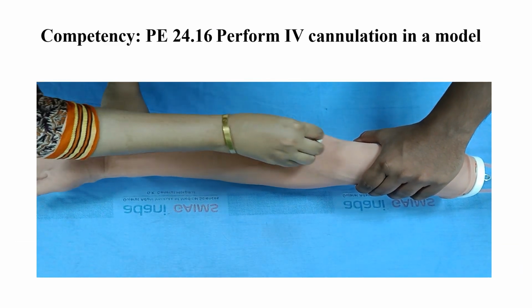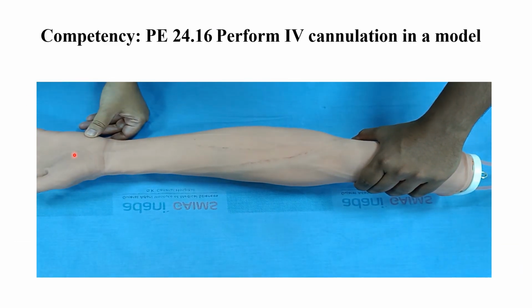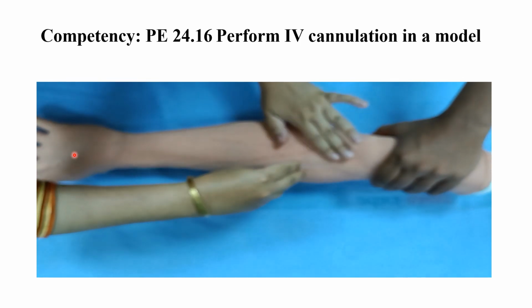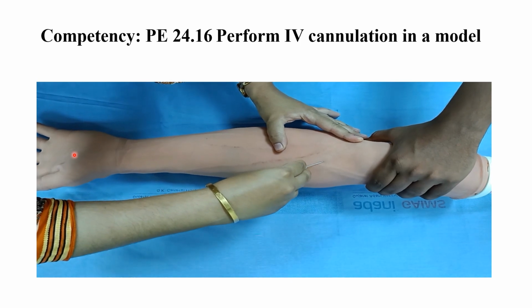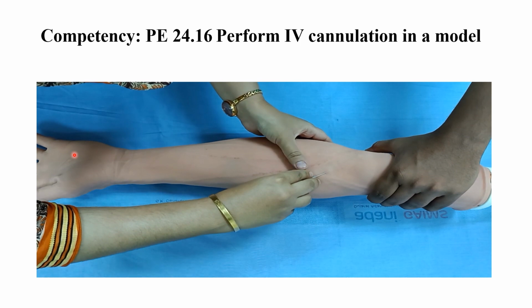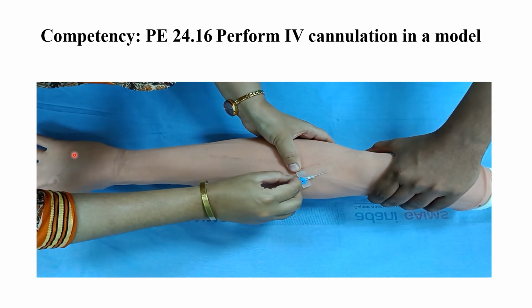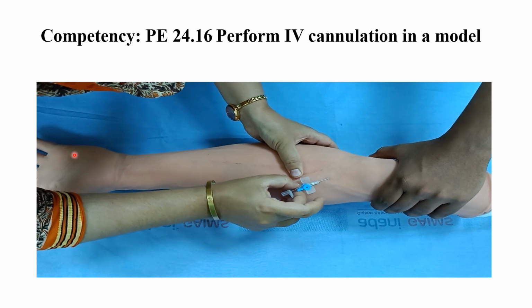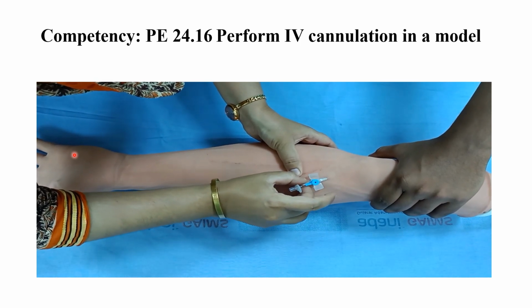Now in this video I am performing the IV cannulation on a mannequin. So undergraduate students have to do IV cannulation on a mannequin during the clinical posting and also during the exam. So this is all about peripheral intravenous cannulation.